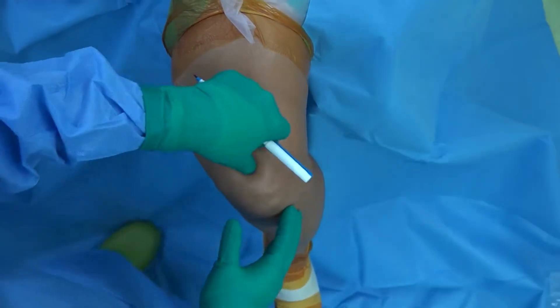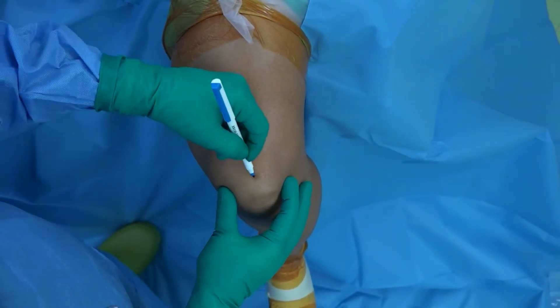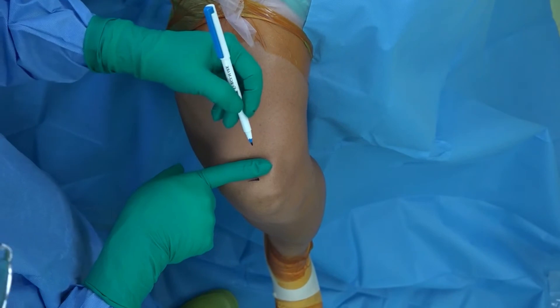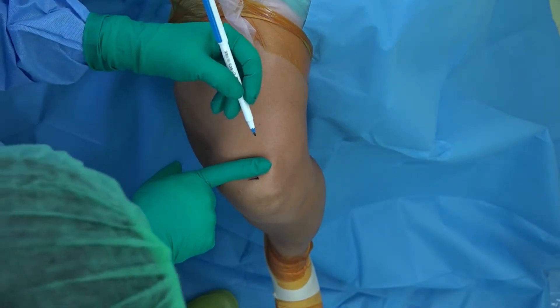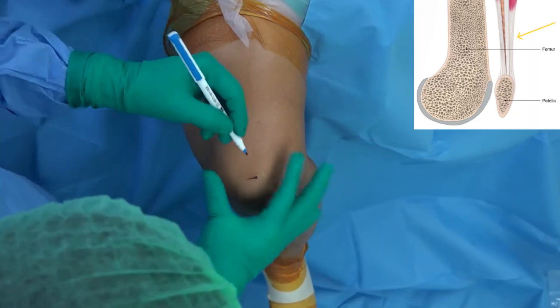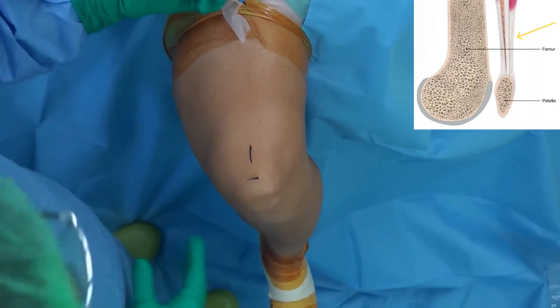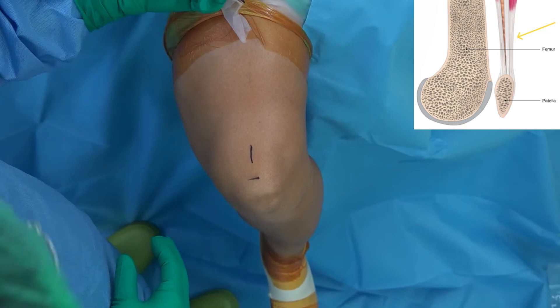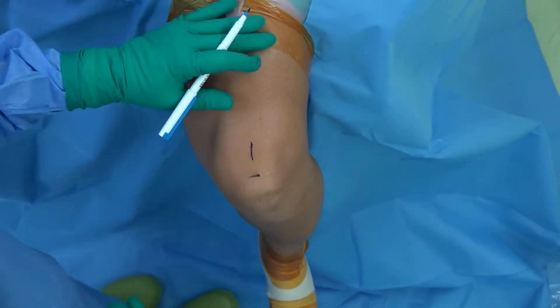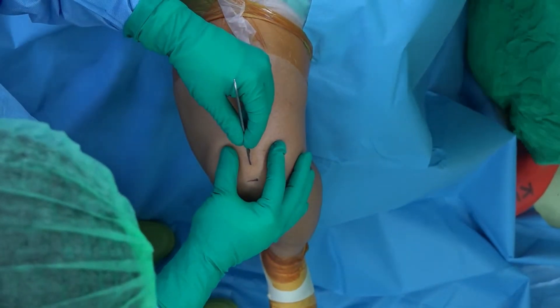In this surgery, the graft was taken from the superficial quadriceps, specifically the rectus femoris tendon. The superficial quadriceps has proven to be reliable, providing a large and long graft with minimal patient complaints.